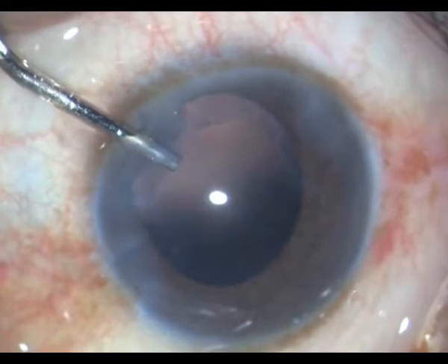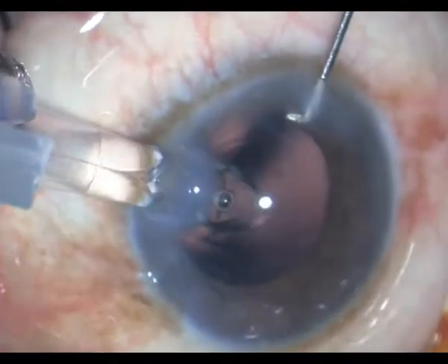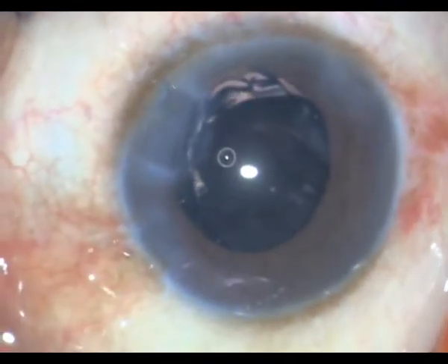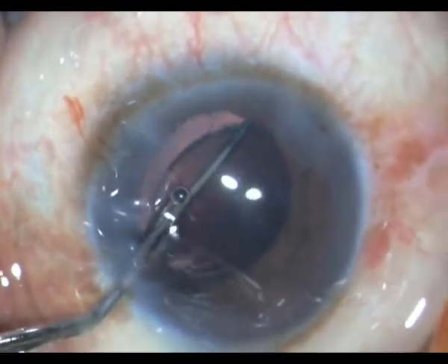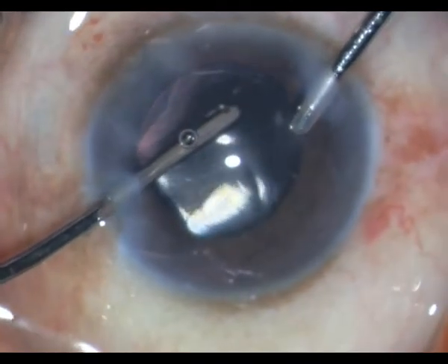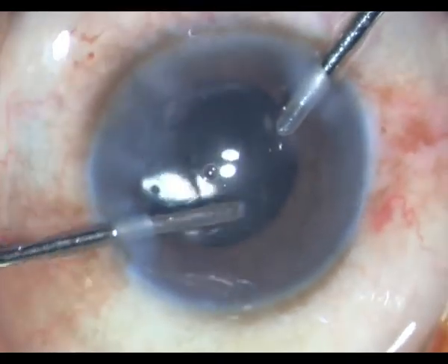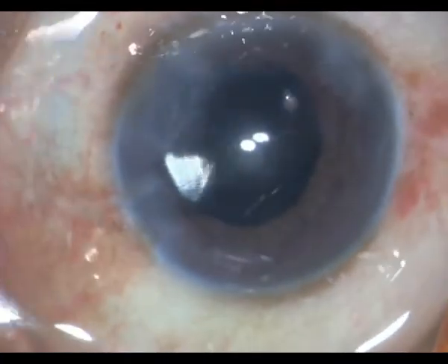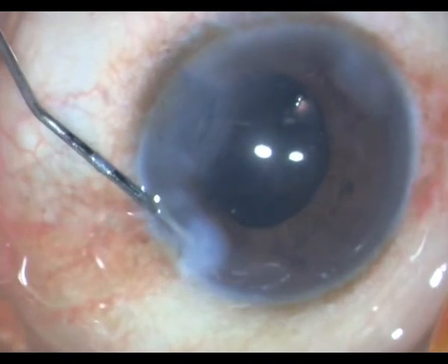Then under HPMC I go ahead and inject a single piece foldable IOL within the bag. The cornea is crystal clear and it remains so post-operatively as well. After placing the IOL well within the bag, I remove all the HPMC from within the chamber. I will then go ahead and place my intracameral antibiotic and hydrate the wounds.